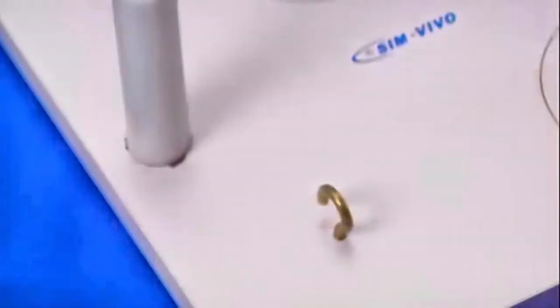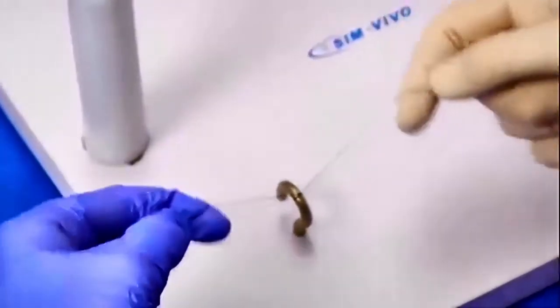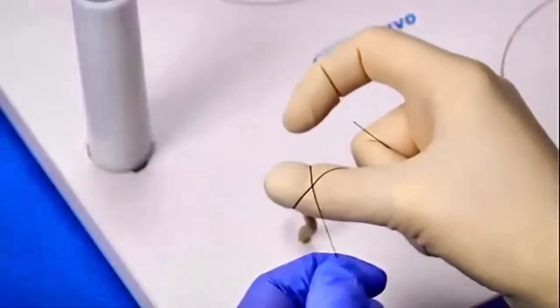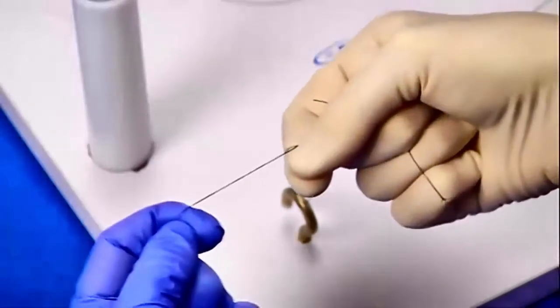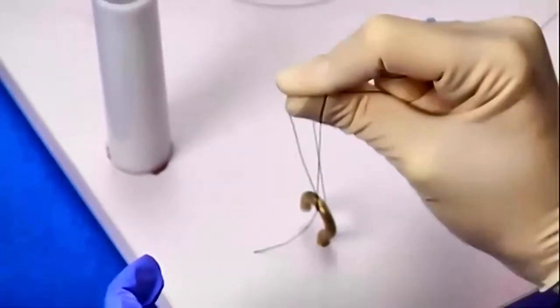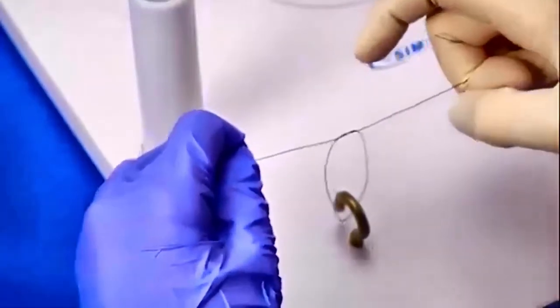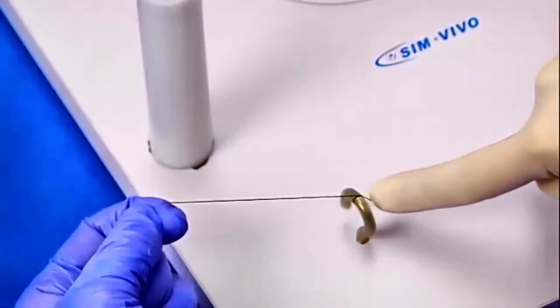Let's review the throw using the thumb as a post. Cross the ends, active hand under passive hand. Hold the ends like the reins of a horse. Hook the active thumb under the suture and push inward. Wrap the other end around the thumb, creating a loop. Oppose the index finger and thumb and push through the loop. Place the free end between the thumb and index finger. Push the free end back through the loop. Retrieve the end with the passive hand and bring the throw down on the hook by maintaining tension with the index finger of the active hand.